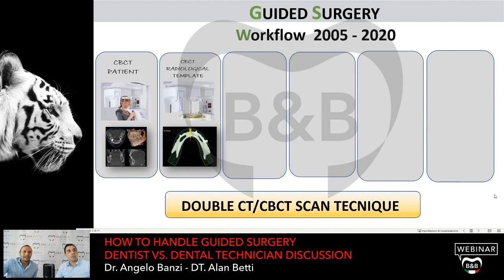And just a few words about the radiological template, because this is a question that our doctors and technicians as well always ask. Which material do we have to use to create this radiological template?